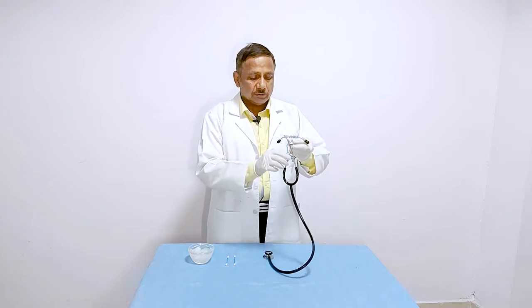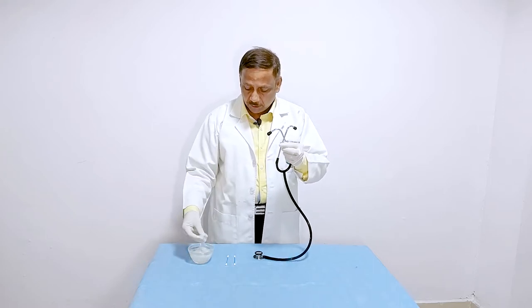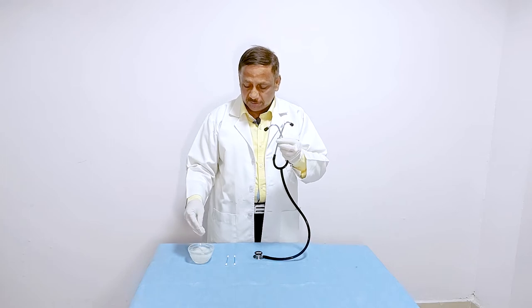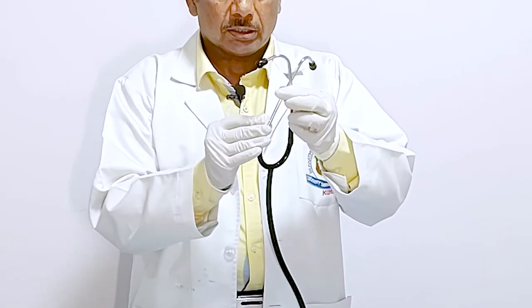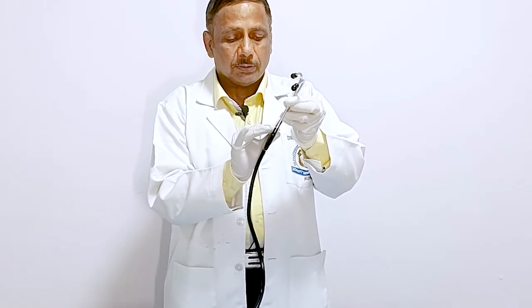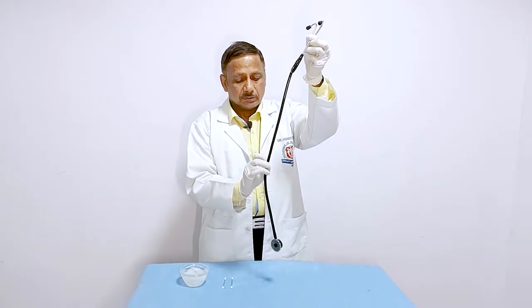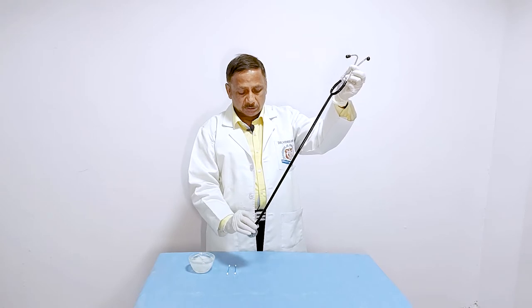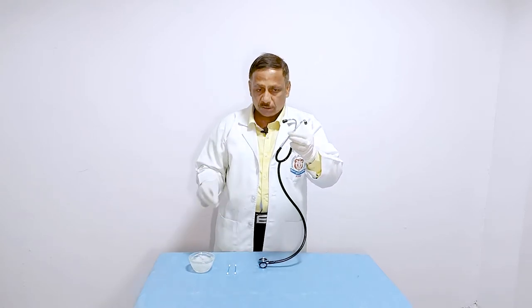When you are cleaning your stethoscope, first of all take a swab soaked in 70% isopropyl alcohol and apply it over the tubing. This tubing is cleaned from above downwards. After this, you discard the alcohol swab.